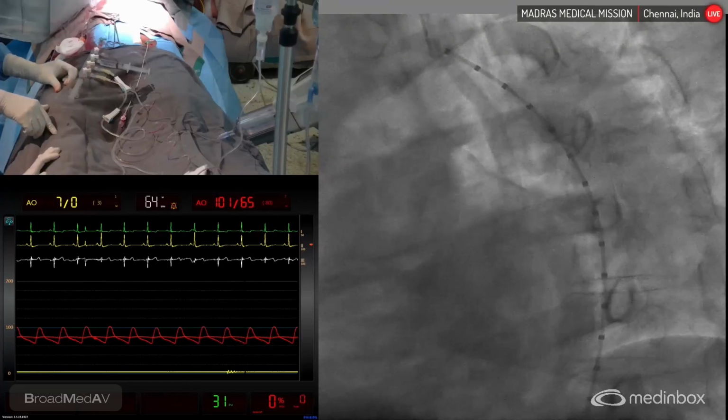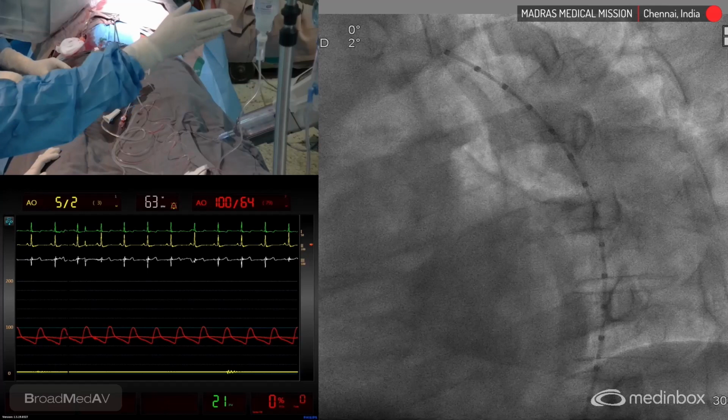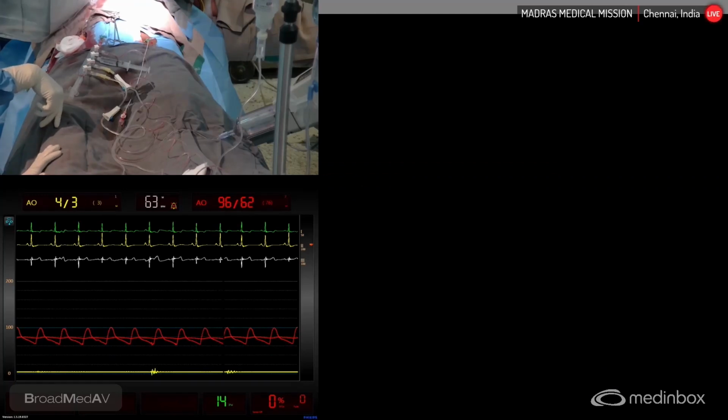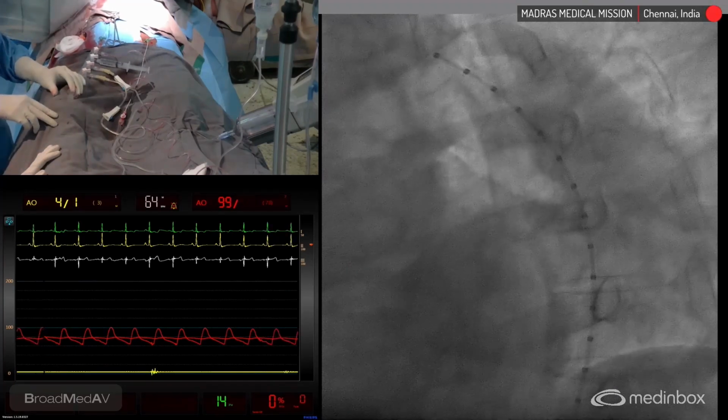Okay. So are we going to take a DSA or are we going to follow it up? We'll take one DSA. Okay, we'll take a DSA. Just cut anteriorly, show a little posteriorly. The aneurysm is extended behind. And for the anesthetist, when we say, you need to have a breath hold.